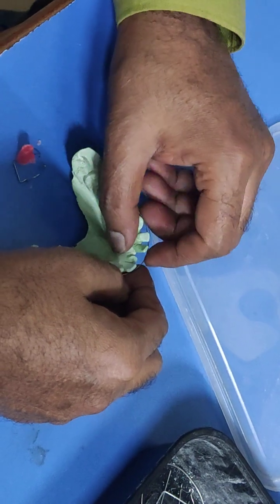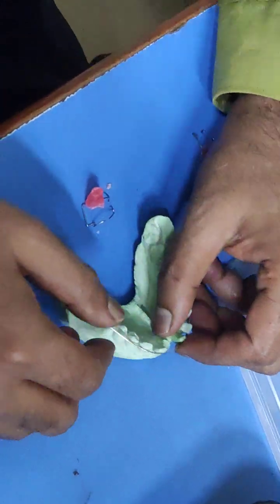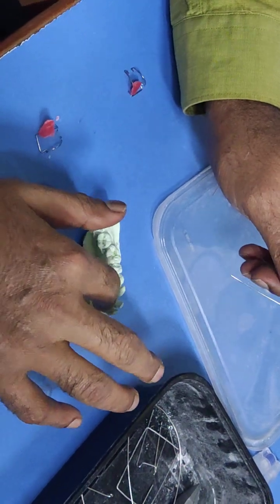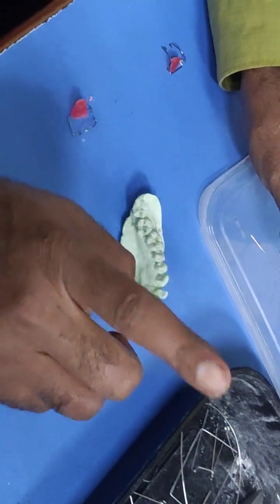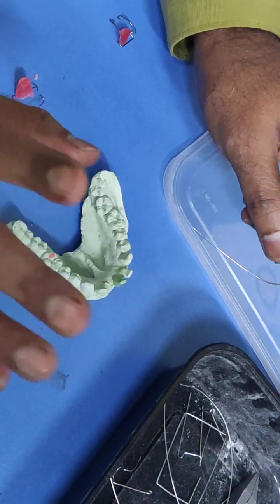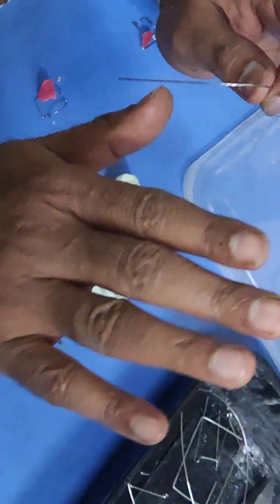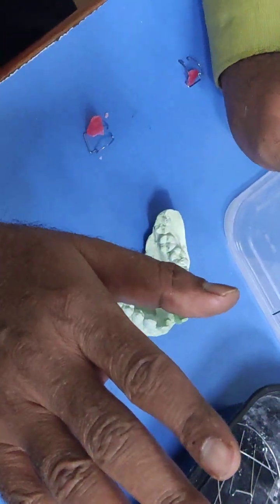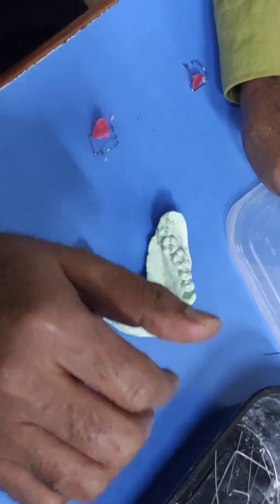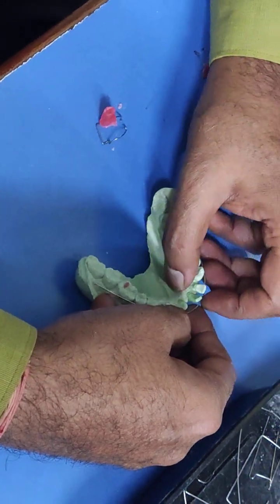Now here we will make a U-loop labial bow. For a U-loop labial bow, the width of the U-loop depends on the amount of space available in the anterior region as well as the amount of retraction required. Obviously, if more retraction is required, the size of the U-loop will be wider, and if less, suppose 1 or 2 millimeter space closure is required, you can make a relatively narrower U-loop.